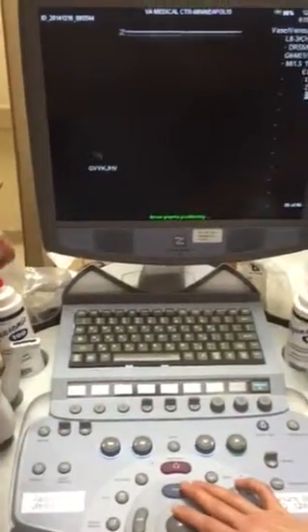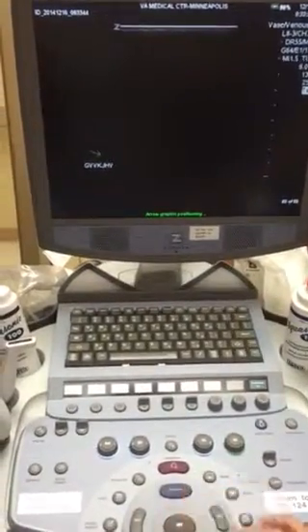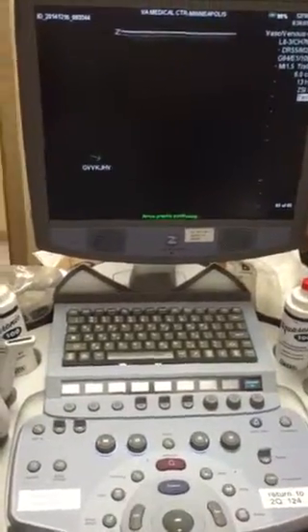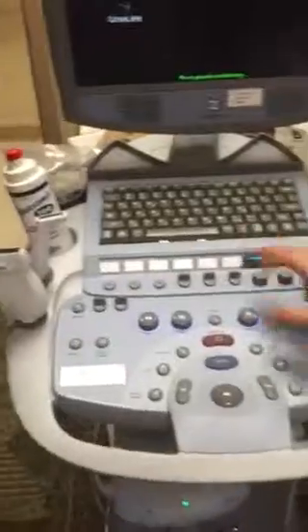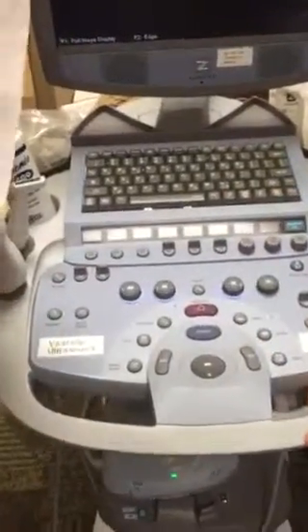And do you want me to leave it thin and green? No, green's fine. You want it a thicker arrow? No, that's good. I think the only thing we wanted was low arterial and RFA. Yes. So we'll get that for you.